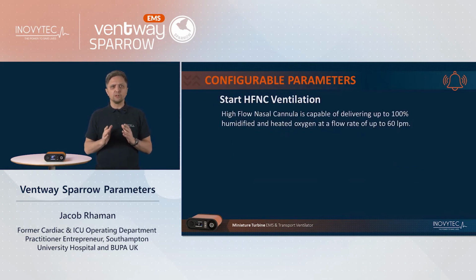It is possible to use a high flow nasal cannula. This is capable of delivering up to 100% humidified and heated oxygen at a flow rate of up to 60 litres per minute.